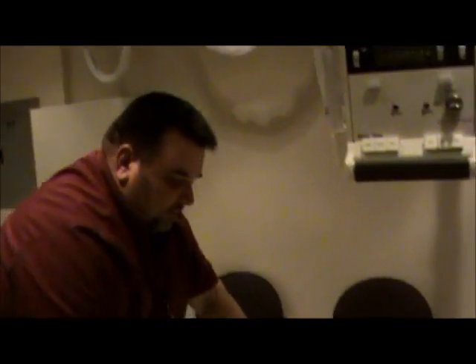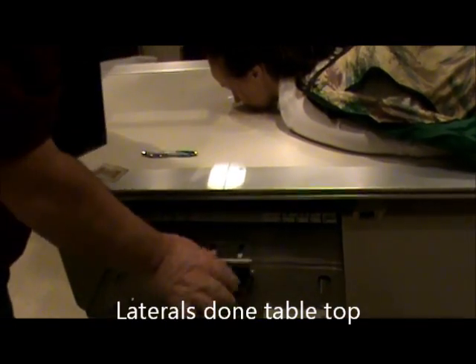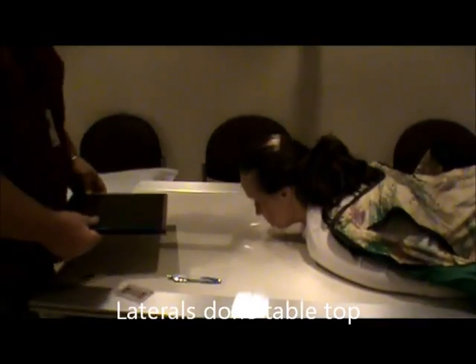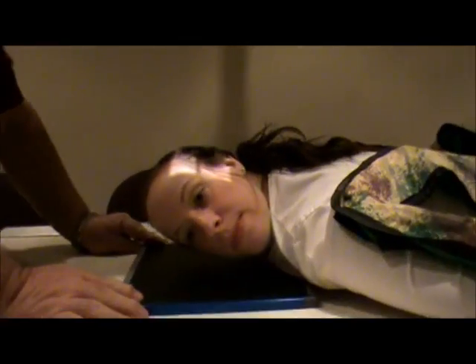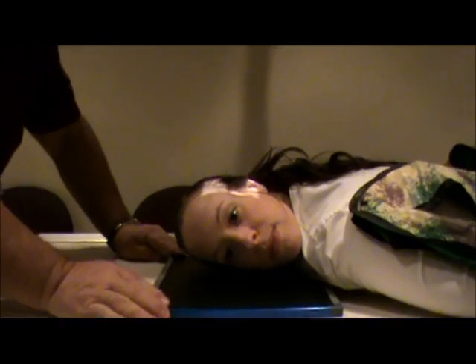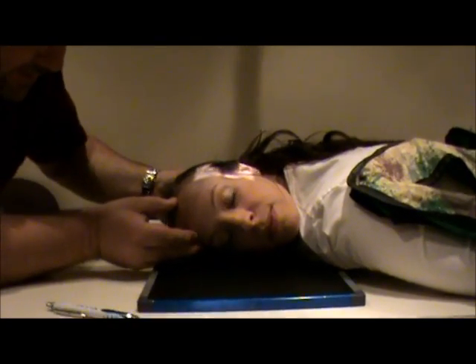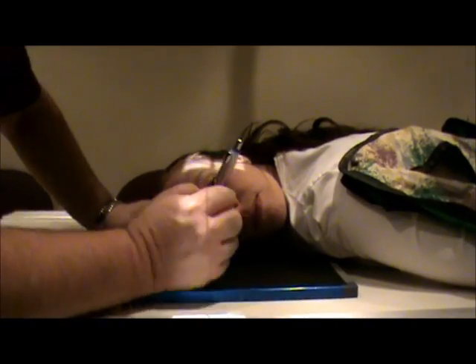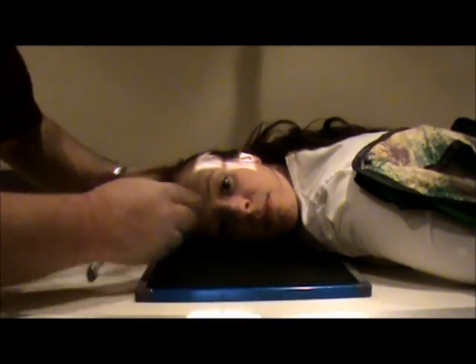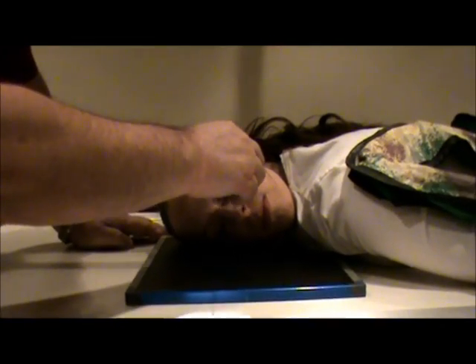The next view is going to be our first lateral. We are going to do this tabletop, so we're going to take the film out of the bucky. We'll have the patient turn the face to the right side. For positioning, we need to do three things: the IPL perpendicular to the IR, MSP parallel, and the IOML perpendicular to the front edge.